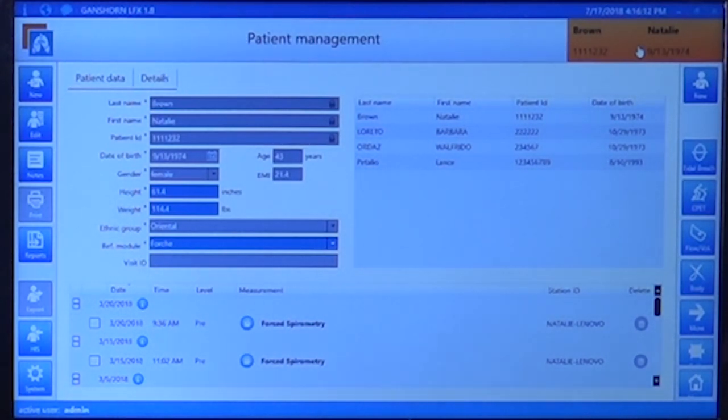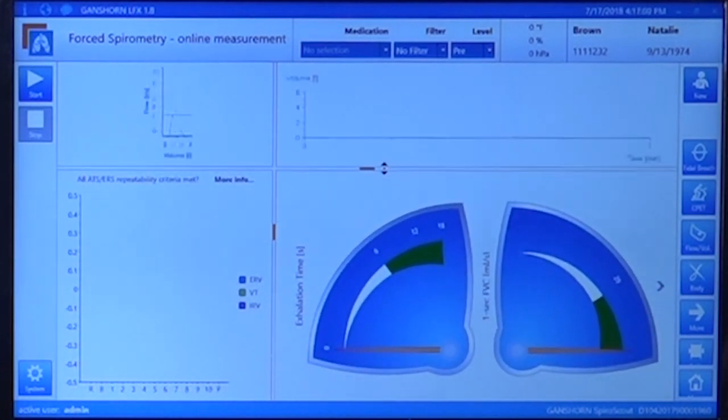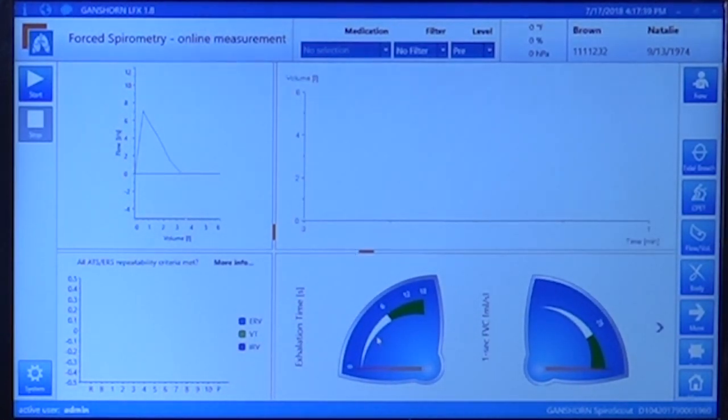The screen shows the flow volume curve with the predicted value, a volume time curve in real time, testing validity on the lower left, and the incentive screen on the lower right. You can change the sizes of these screens — make the incentive bigger so the patient can see it, or smaller. For an adult patient, two speedometer-like screens help the patient achieve the six seconds of exhalation required for spirometry and the one-second FEV1 in milliliters per second.